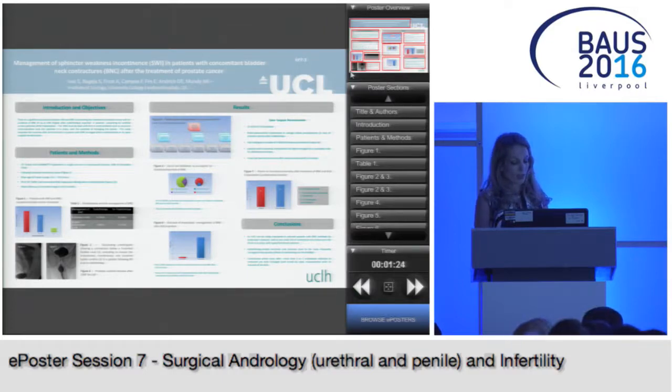In 7 of these 50 patients, this was repeated if the contracture had recurred at 3 months. Otherwise, in 19 of the patients, the recurrent contracture was treated with an open revision of the vesicourethral anastomosis. A few patients performed self-dilatation to help stabilize the contracture, but only 3 had to continue with self-dilatation in the long term. 3 months after satisfactory management of the bladder neck contracture, an artificial urinary sphincter was implanted around the bulbar urethra, generally with satisfactory results.